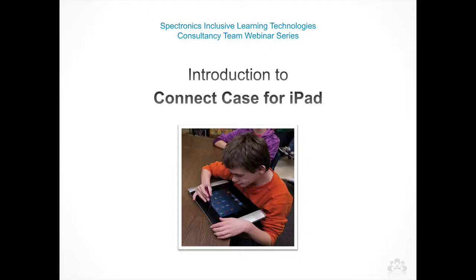Welcome to this video, which is an introduction to the Connect case for the iPad by AbleNet.